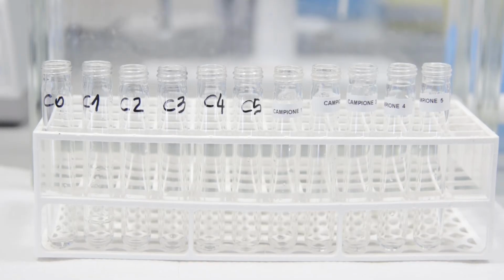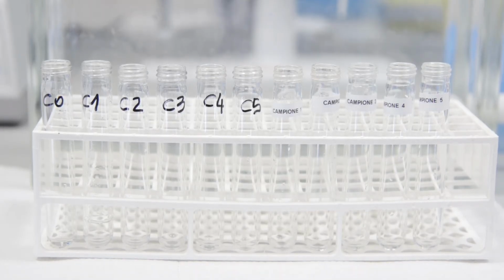The last phase, the elution, must be carried out strictly in Pyrex glass tubes with a stopper. Now you are again at a crossroads. You will have to follow a different elution mode, depending on whether you need to confirm an amphetamine or other basic drugs of abuse.